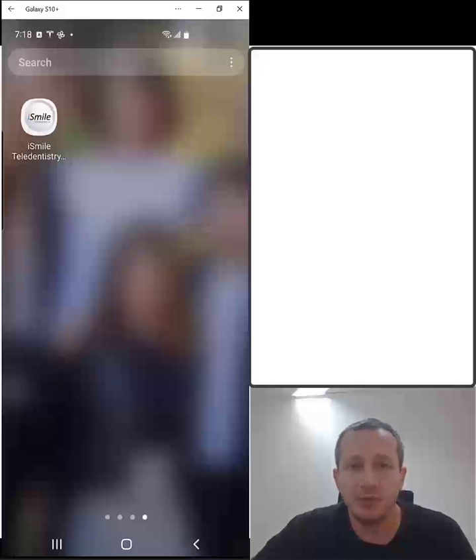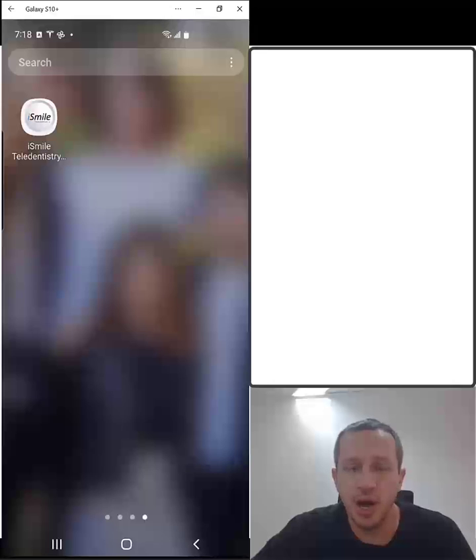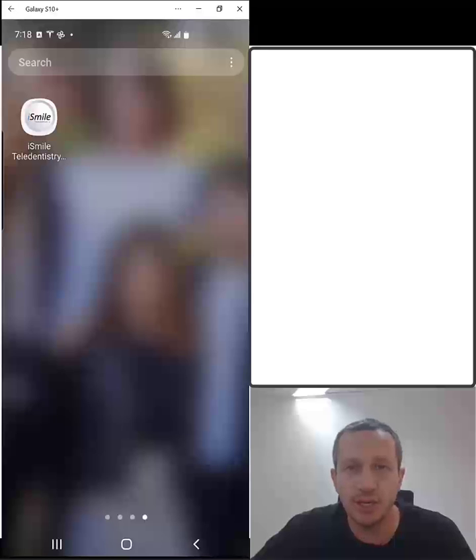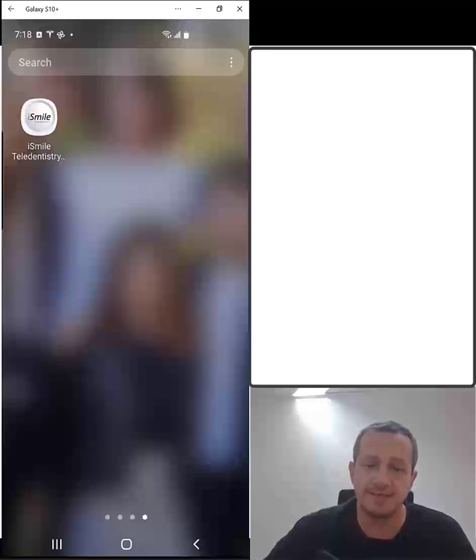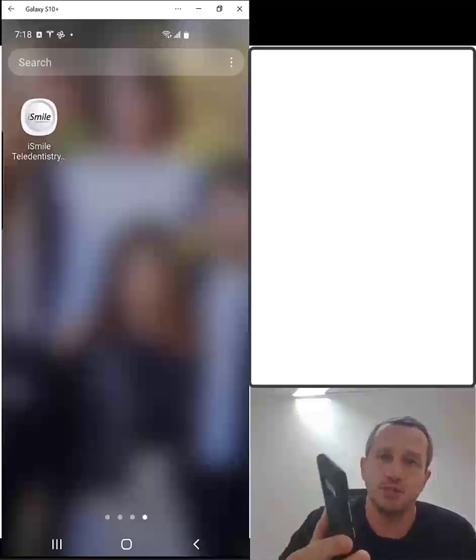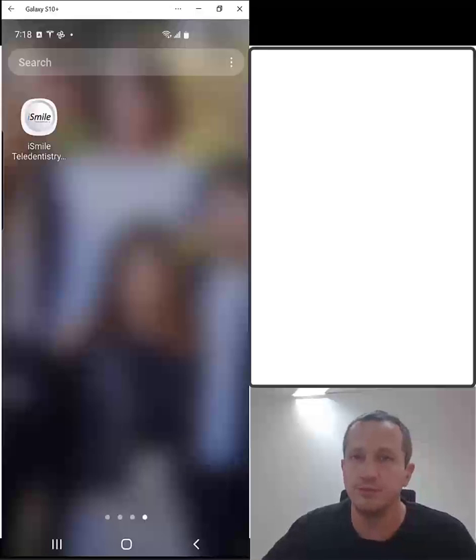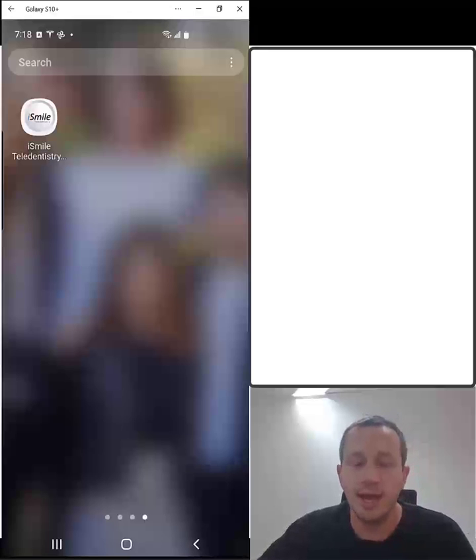Hello everyone, this is Michael from iSmile. I'm going to be demonstrating our new iSmile simulation functionality. As you can see on your screen, I'm casting my cell phone to my screen so you can see my cell phone screen.